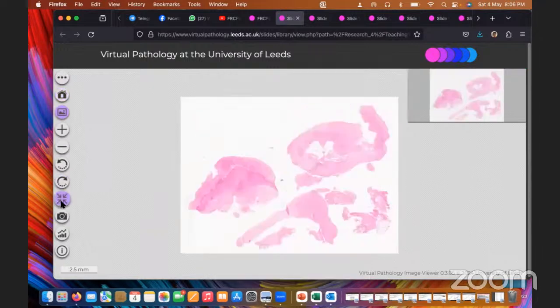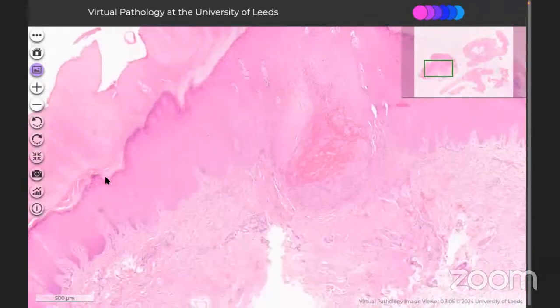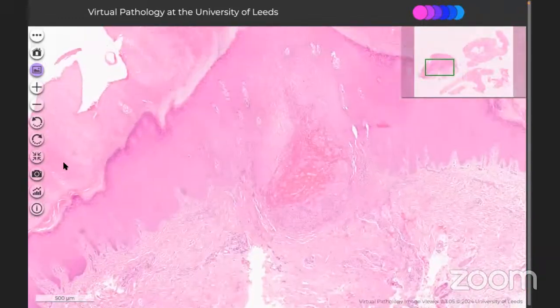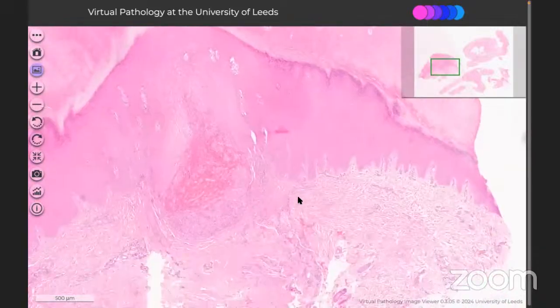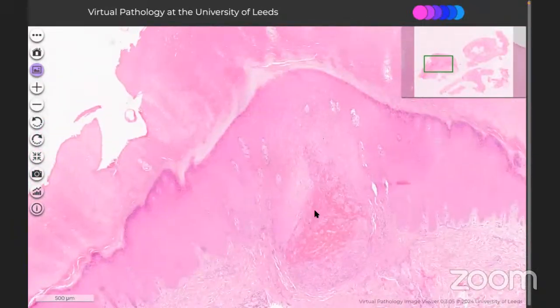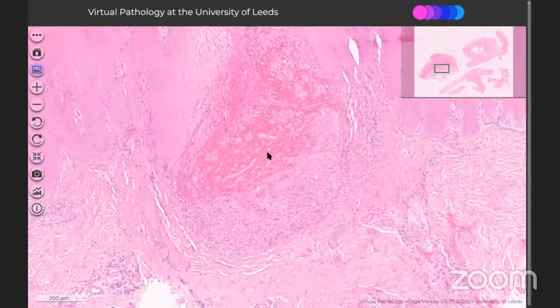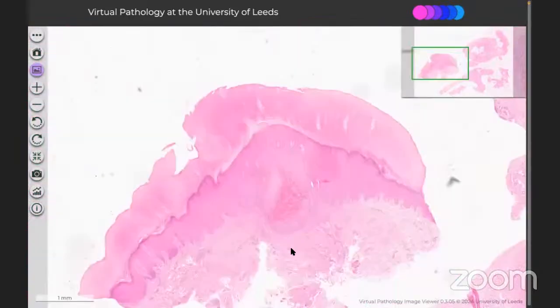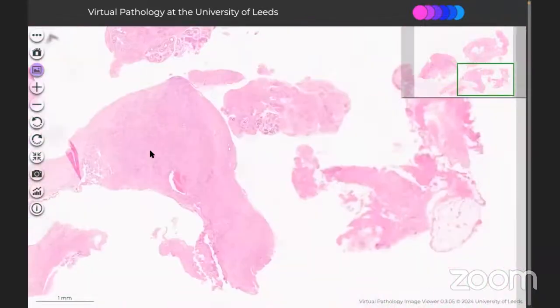Okay, and one of them is lined by squamous epithelial cells with this kind of tiers of keratin, which is suggestive that this is taken from the digit or from the acral site, and there is an area of hemorrhage here. So this can be due to some trauma, and there is some histiocytic aggregate over here. This biopsy is not very useful other than only acanthosis there.